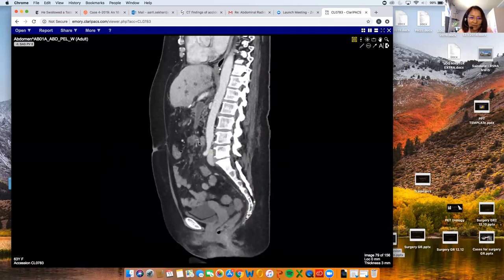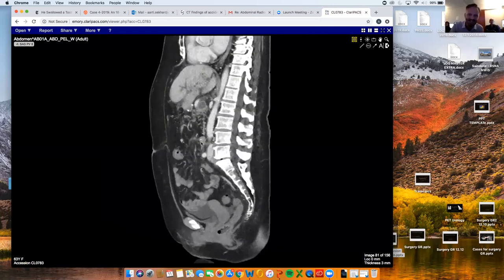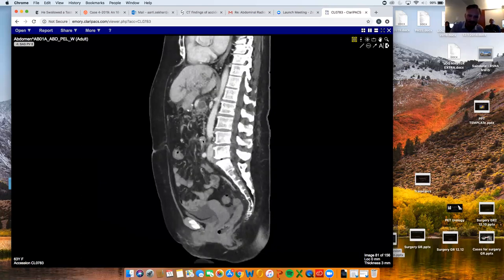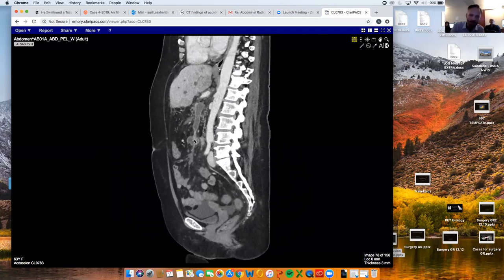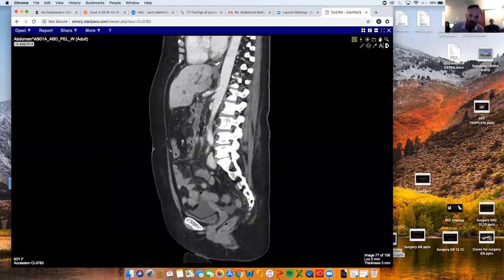They all look the same once you recognize it. So yeah, here it is. This little linear thing that's not an artifact is coming out of the third portion of the duodenum. It runs anteriorly, goes right through a superior mesenteric vein branch, and into this little collection of fluid or thrombus or something.